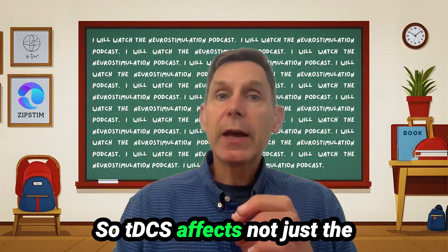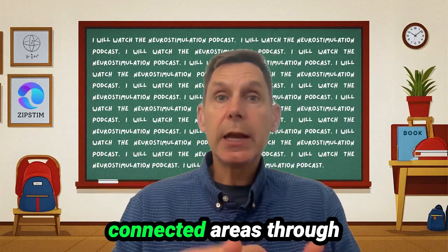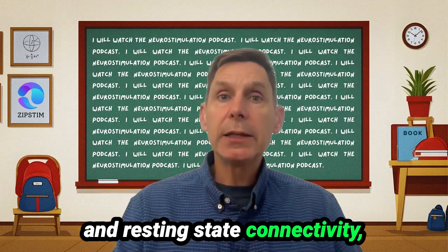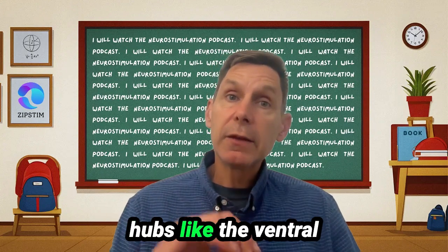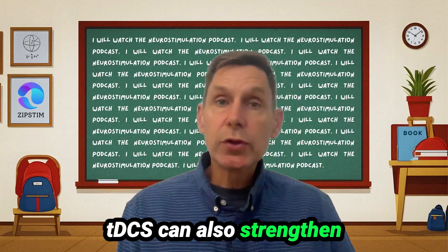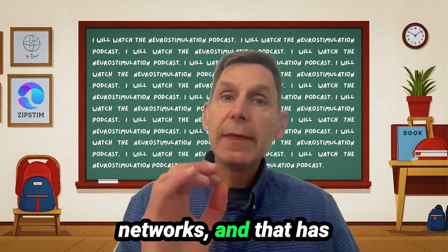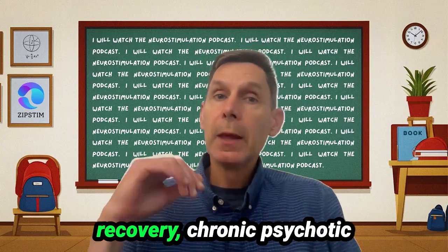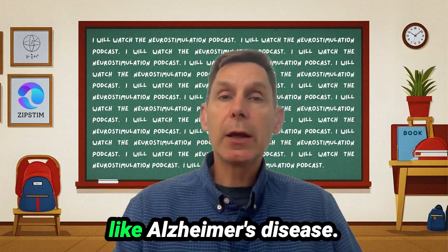So tDCS affects not just the region under the electrodes, but also functionally connected areas through changes in signal propagation and resting state connectivity, including between frontal cortex and subcortical hubs like the ventral tegmental area, or VTA. tDCS can also strengthen or weaken communication within large-scale brain networks, and that has powerful implications for conditions like stroke recovery, chronic psychotic conditions like schizophrenia, and neurocognitive disorders like Alzheimer's disease.